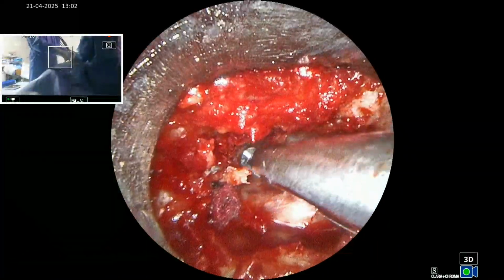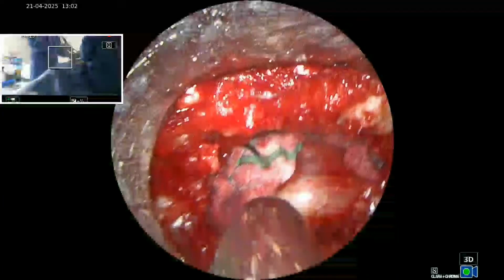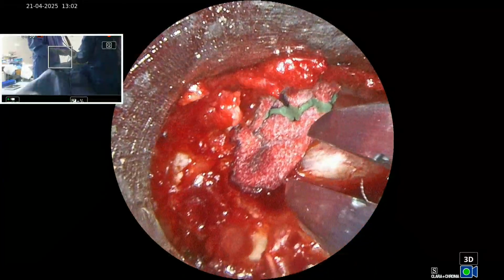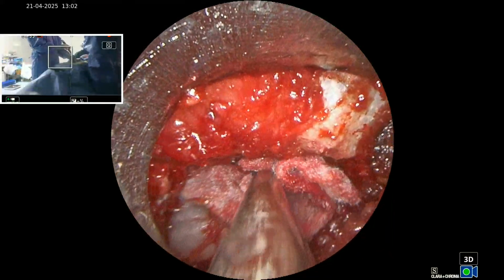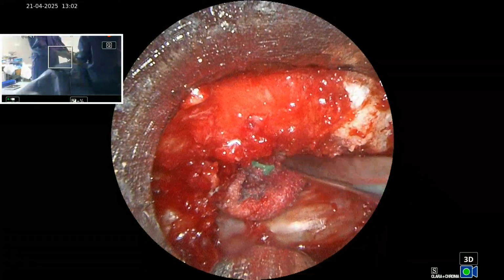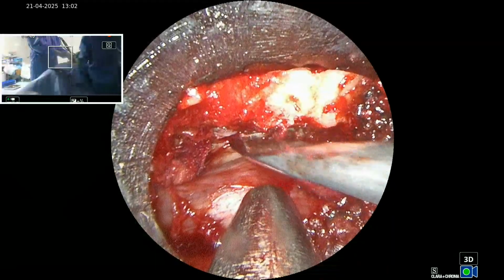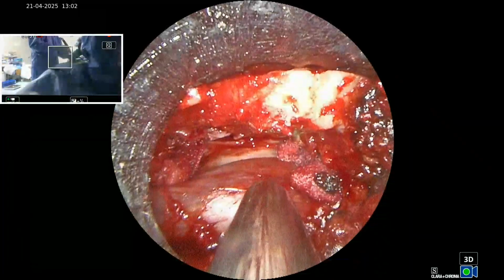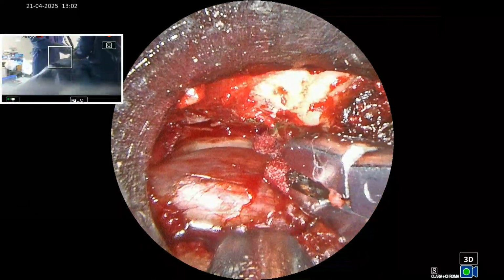These are the hypertrophic portions of the opposite side lamina, the discs. Now we are on the opposite side. This foramen. Now let's see if you can assess the foramen or not. Yes. So there is my nerve root and this process. Very tight canal.